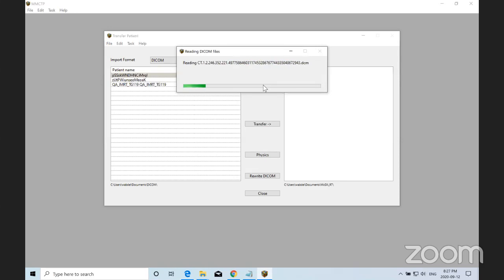One of the other concerns I have for potentially why the calculation didn't run would be how we changed the patient's name. And we can go into a little bit more depth into changing the name for this patient as well. I will leave everything now, just so that we make sure that the calculation runs. Sure.